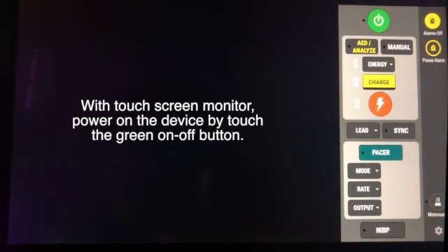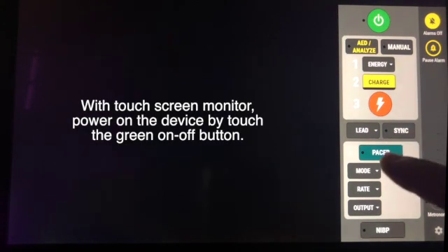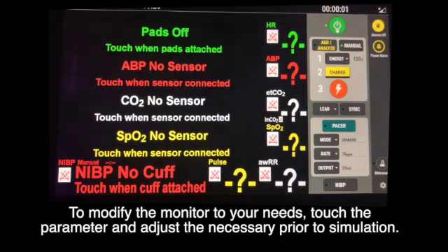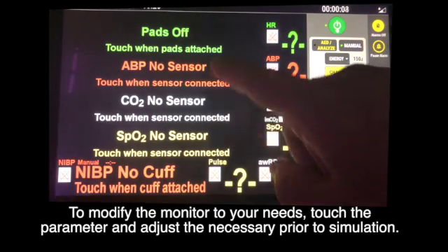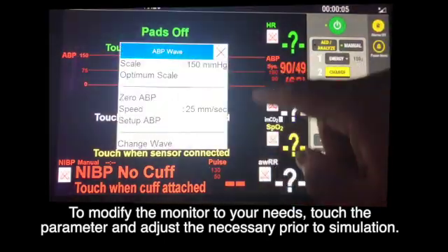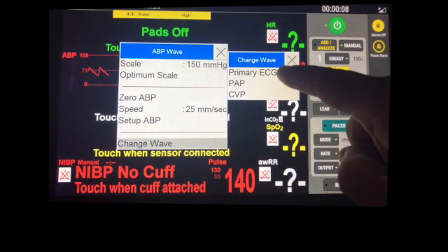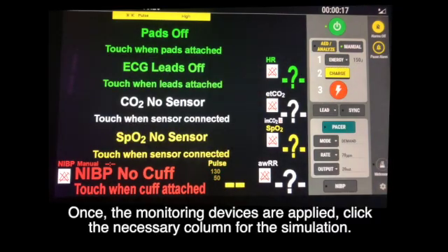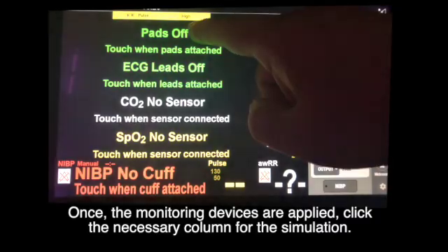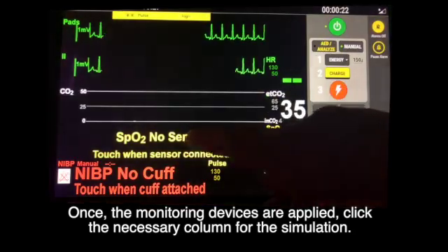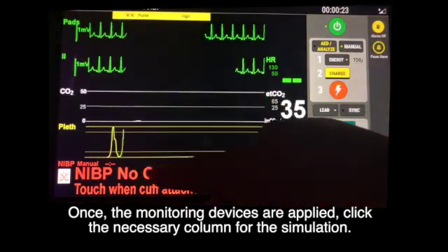With the touch screen monitor, power on the device by touching the green on/off button. To modify the monitor to your needs, touch the parameters and adjust the necessary settings prior to the simulation. Once the monitoring device is applied, click the necessary column to activate it for the simulation.